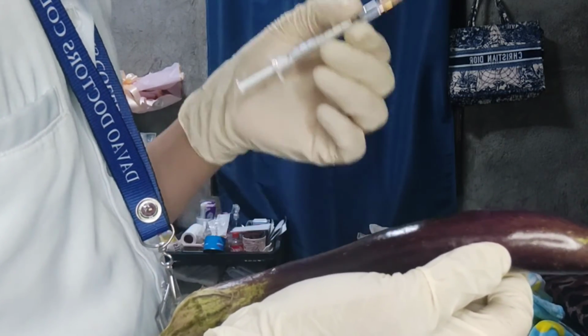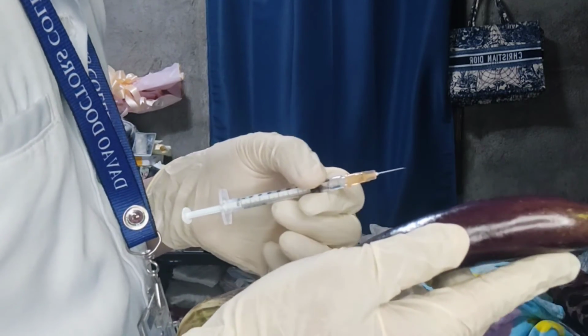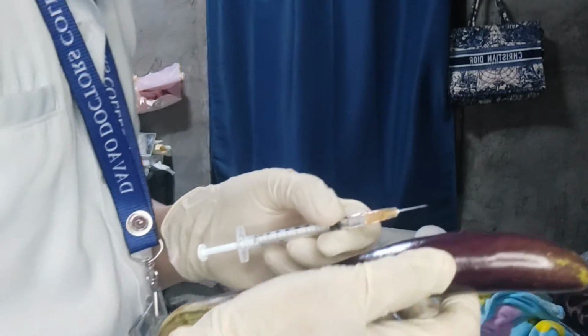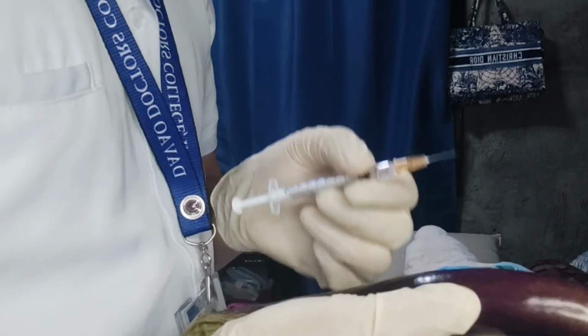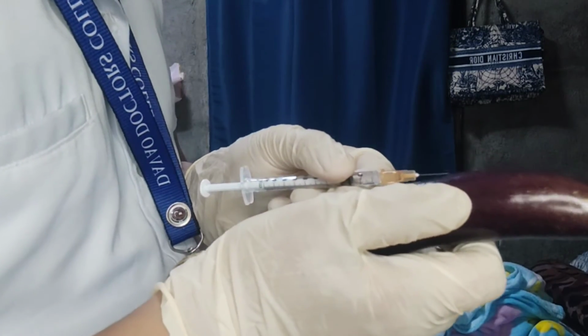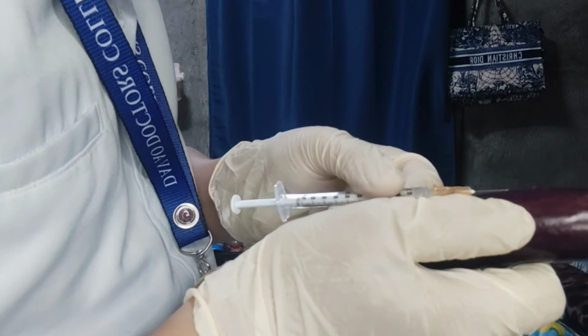Don't push too hard, so that the patient will not feel more pain. Otherwise, we need to withdraw. So first, we use the 15-degree angle, just like this.